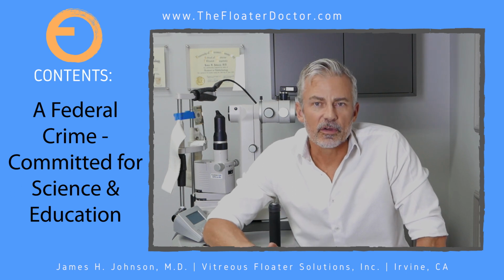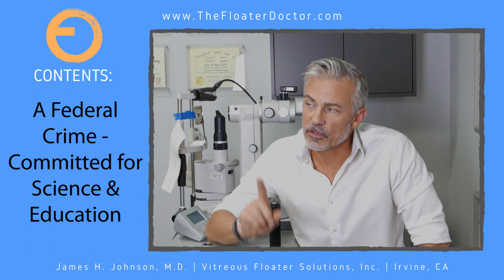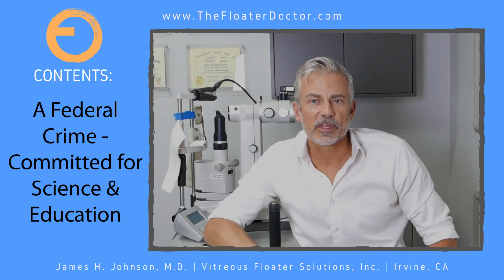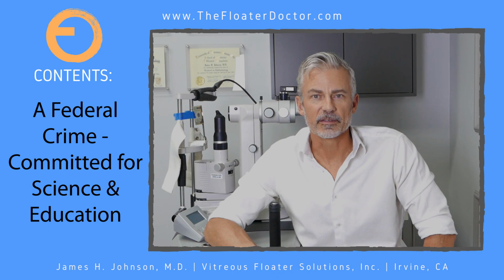Before we get started though, I have to ask you this. Please do not turn me into the Department of Treasury, okay? Or all this could go away. And before we get started, we have to go over to the whiteboard and learn a little basic science and basic physics with the YAG laser before we come on over here and do our demonstration, okay? So let's get started.